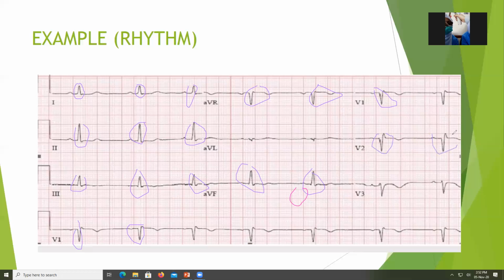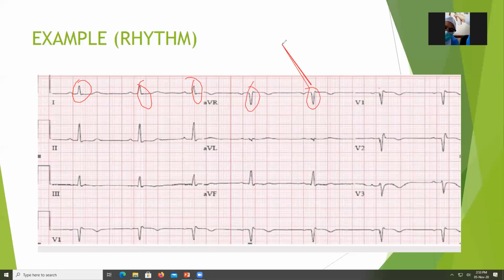So yung mga QRS natin, these are QRS. Okay. Ayun nga rin. Na-erase. Again. So ito yung QRS natin. These are QRS. I forgot that this one is touchscreen. Touchscreen, no social touchscreen. My monitor is actually touchscreen. That's why when I touch it, it actually. Yes. It's so sensitive. Yes. So, wala ma'am, touchscreen pala to, social. Yan. So these are my QRS complex at QRS wave. Napaka-sensitive ng screen na to, ma'am.